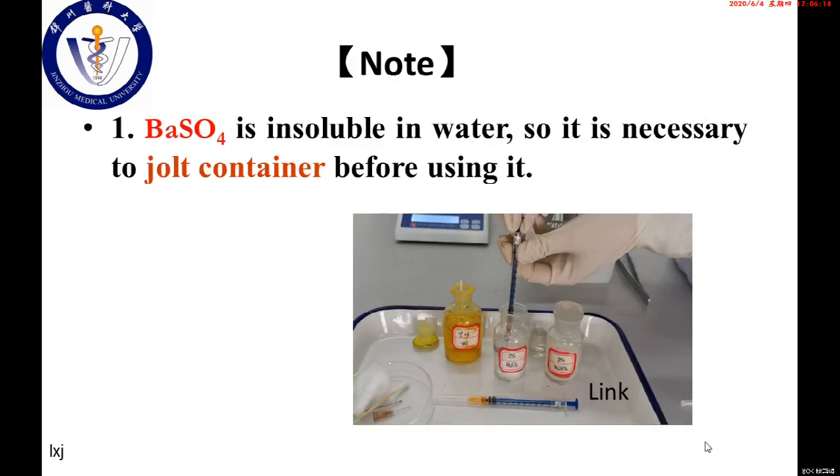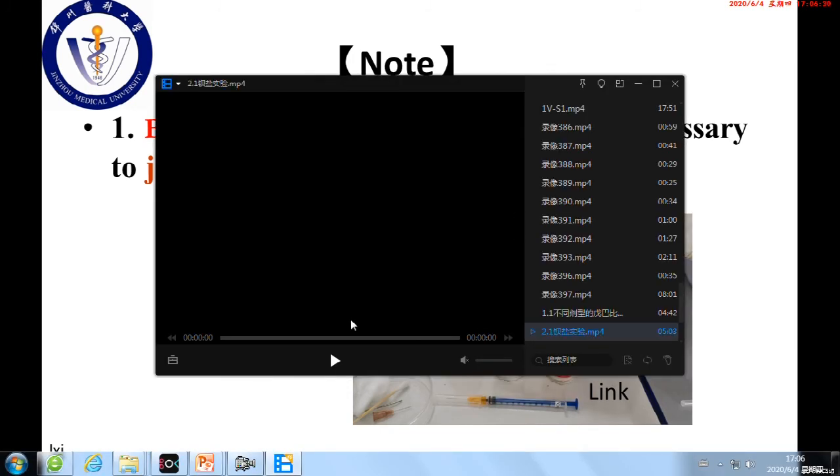Note: because barium sulfate is insoluble in water, it is necessary to shake the container before using it. Now, please watch the video. This is the process of this experiment.